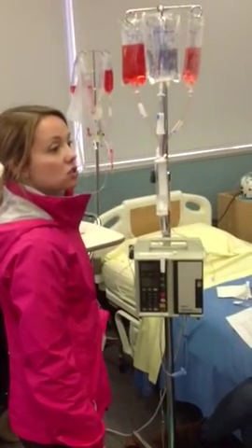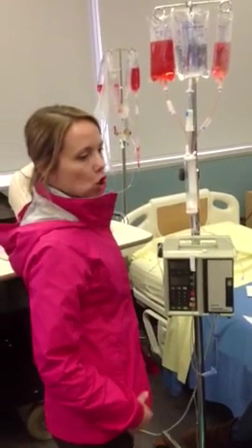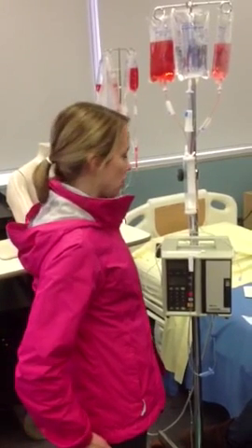This Buretrol is used for children so that you don't overhydrate — overload — them.